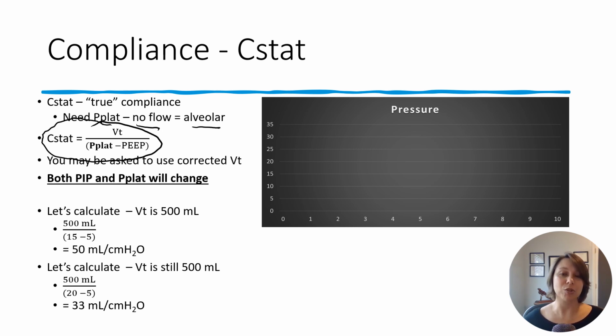You may be asked to use corrected tidal volume. I'm going to do a slide on that at the very end, just in case you are being asked to do that. Not every program does. It's important to note that with compliance, both our PIP and our PLAT is going to change. So let's take a look at it on our pressure graph.